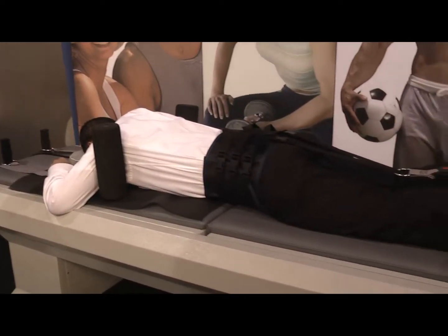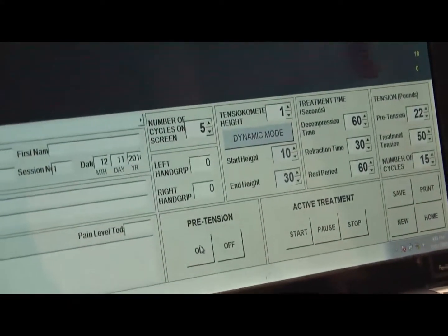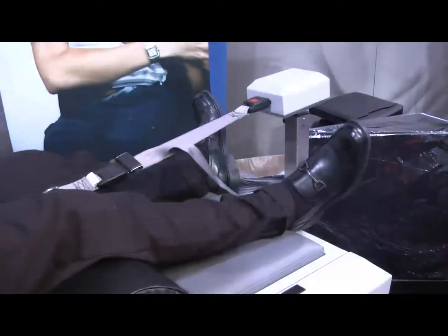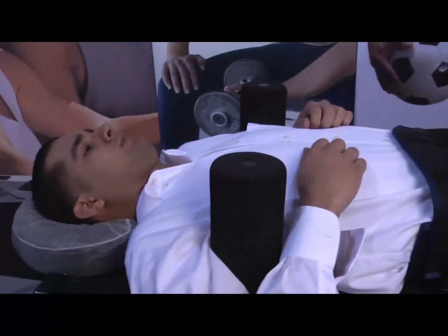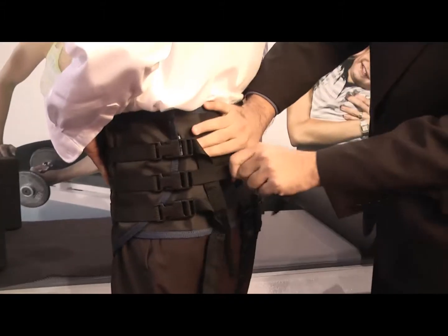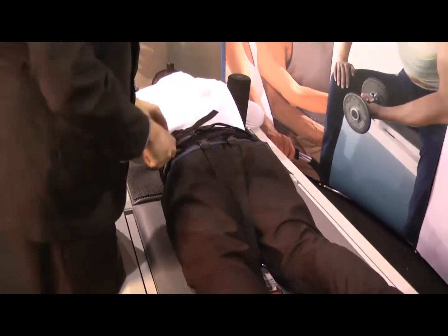The equipment is made of basically two pieces: the table and the laptop, which controls the machine. It uses biofeedback to measure the pounds being applied to the person. For example, if the patient is doing 50 pounds, it'll maintain that tension throughout the whole treatment. The patient will have a harness around his waist with a strap connected to the tensionometer.